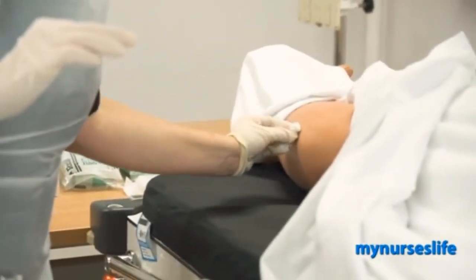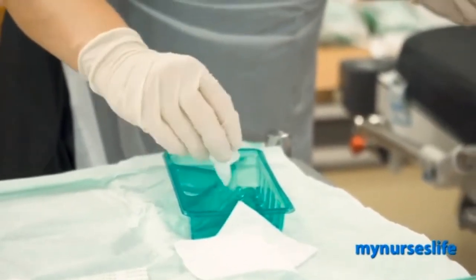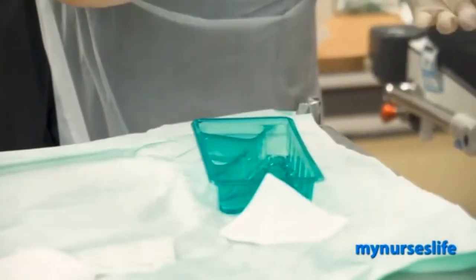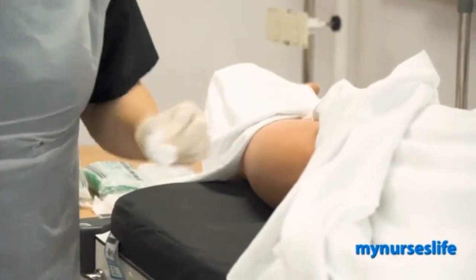Cleaning the outside of the wound. And gently irrigating the top part of the wound, just keeping it moist. And cleaning and drying the outside parts of the wound as I go.